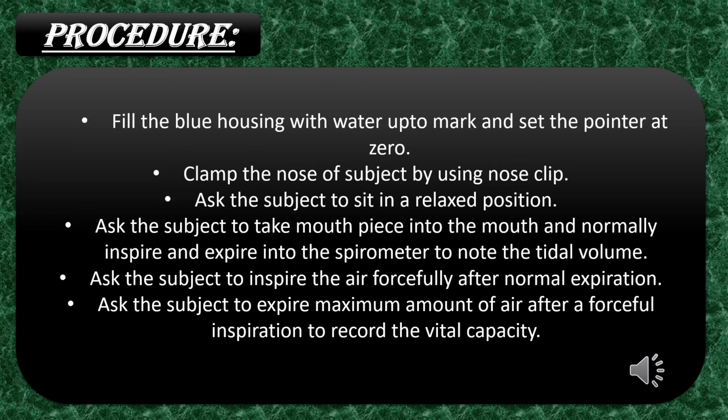The procedure of the experiment is: firstly, fill the blue housing with water up to the mark and set the pointer at 0. Then clamp the nose of the subject by using a nose clip. After that, ask the subject to sit in a relaxed and comfortable position. Then ask the subject to take the mouthpiece into the mouth and normally inspire and expire into the spirometer to note the tidal volume.